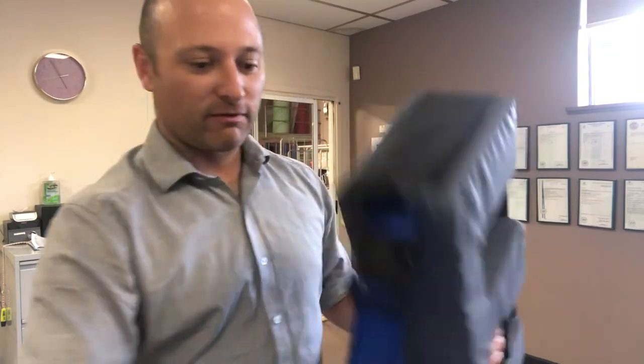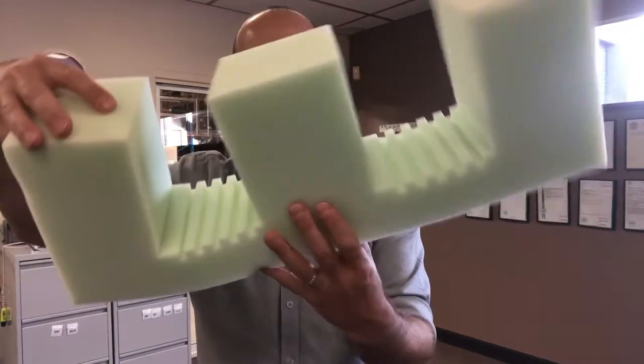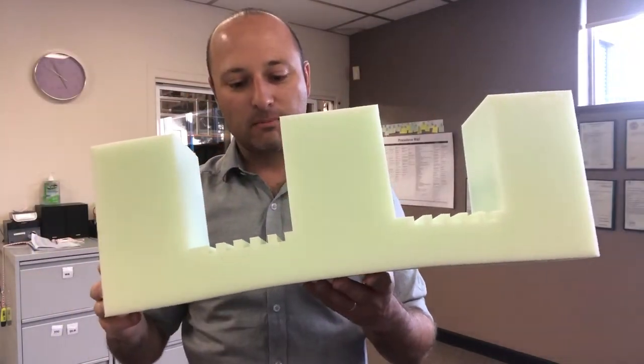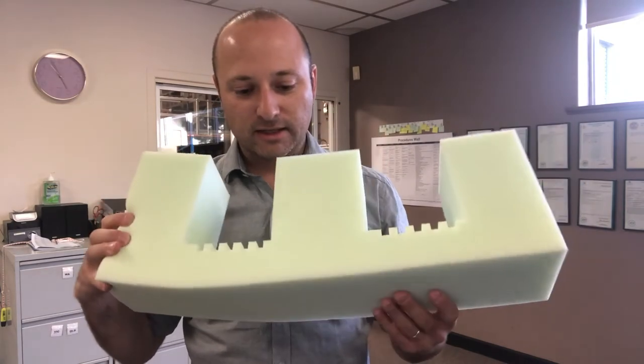A couple of features of the foam which I've got here. You can see we've got convolutions cut into the foam where the legs rest, and that's just to give better blood circulation under the legs.